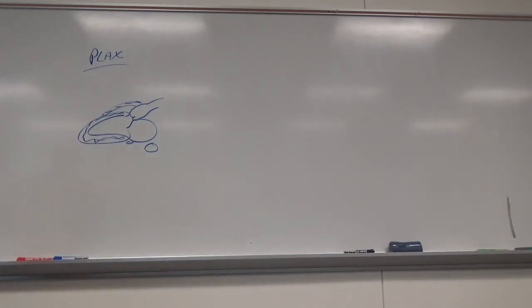We do sometimes measure walls in systole, and I'll have you measure for now, but most labs don't. Why do you think we don't use systole as regularly as we do diastole? Because diastole is at rest. So diastole is at rest, yes.